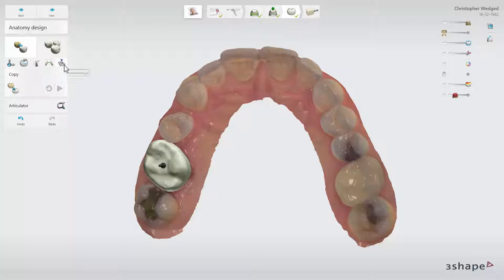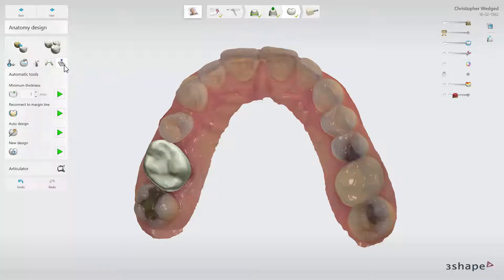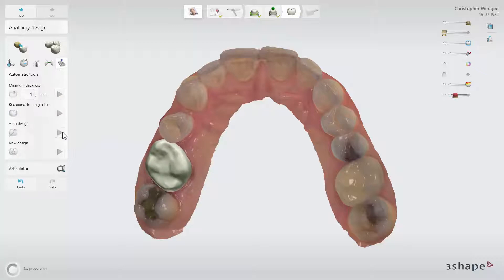For example, you can go to Automatic Tools and click Auto Design to create a valid design of the copied tooth.